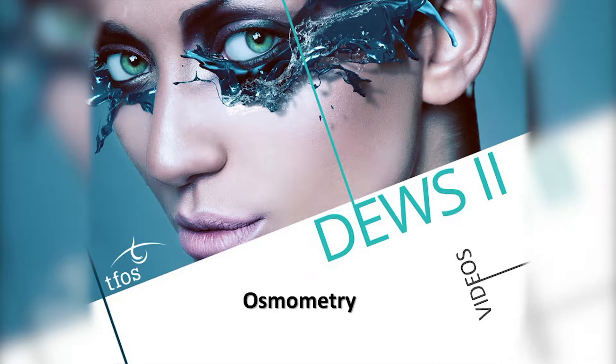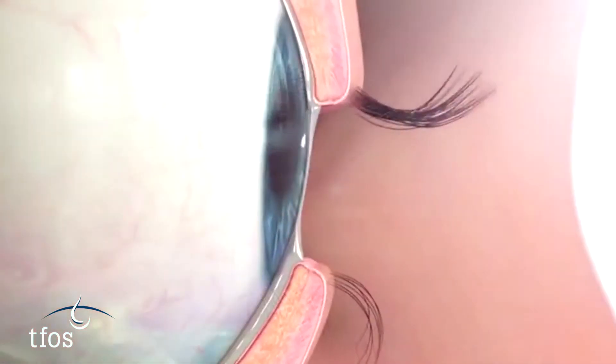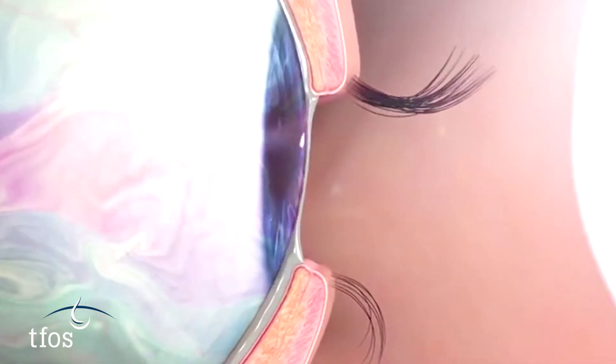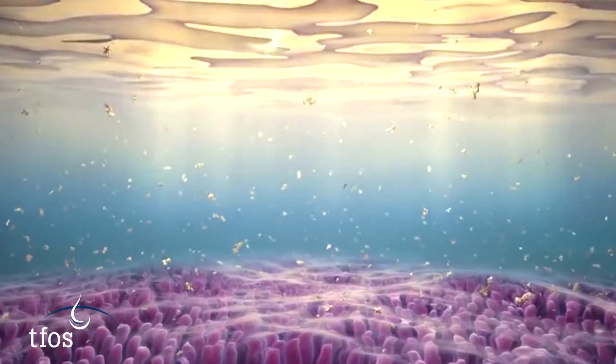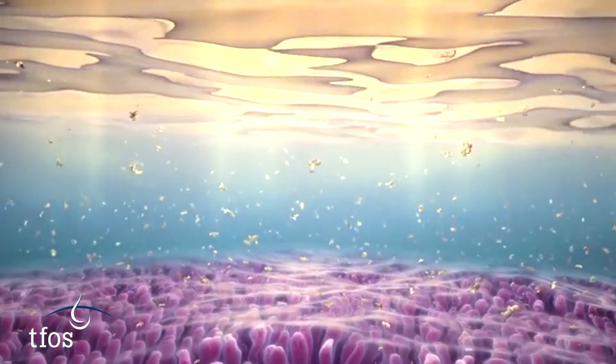Evaluation of the osmolarity of tears collected from the meniscus provides an objective measure of global tear quality. Dry eye, irrespective of whether aqueous deficient or evaporative in nature, results in tear hyperosmolarity with a higher than physiological solute concentration.